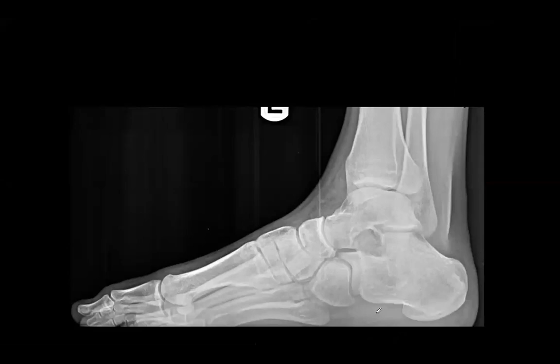All right, who wants to cover abnormal angles on a pes cavus foot? I can try this one. Okay. So what do you see that would, when you start describing, you know, is pes cavus? I'm going to start posterior, so with the calcaneal inclination, it's increased, we don't have too much of it, but you're correct. That's what we would see. And then decreased talar declination. Okay, it's going to be more flattened, right? Right. Good. And then Meary's angle right there would be positive.